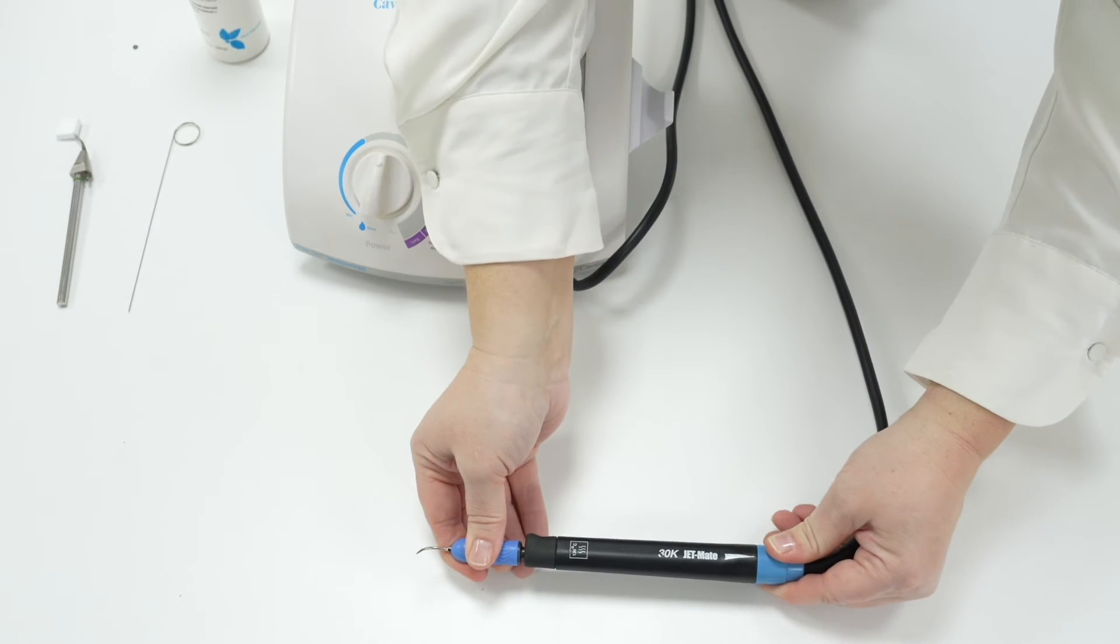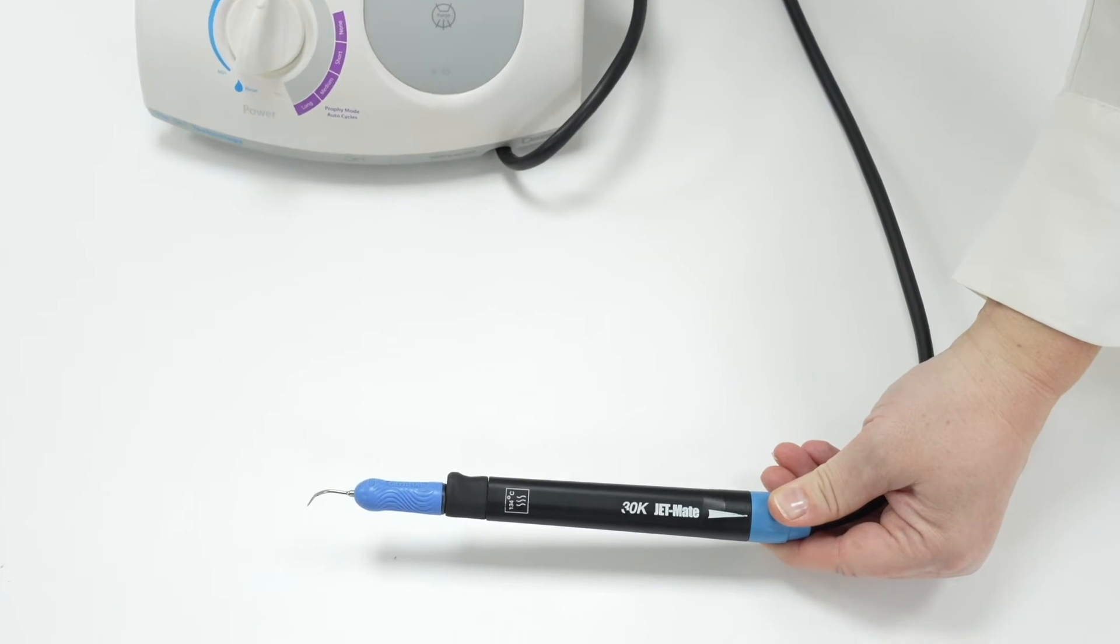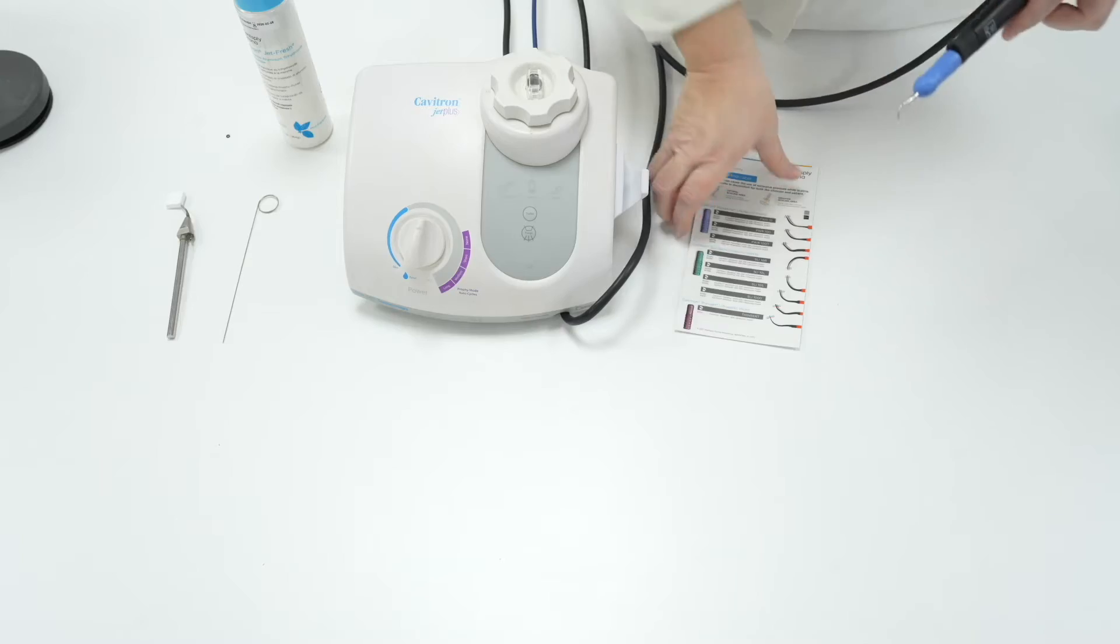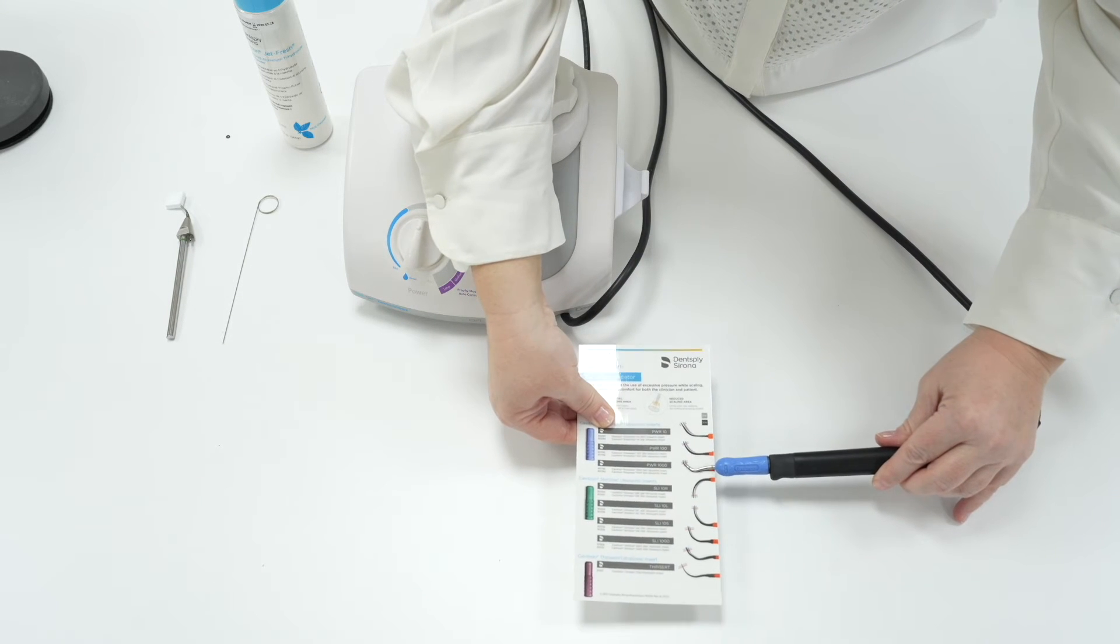The insert should be nice and straight and dropping clear of the sides of the JetMate. You should not have to push the insert in. Please measure your inserts before use to make sure they are within length tolerances to be effective and work effectively.